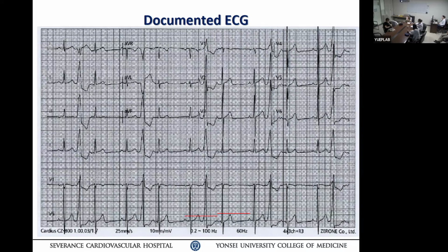But the biggest mistake is that they try to rotate a catheter without a guide wire. This is a problem, because these veins are more fragile than you think, much more fragile. So be careful with this stuff. Now, if you dissect, is there tamponade? No, unless you perforate with an ablation catheter. We never had dissection with tamponade. Like your LV lead replacement, same thing. Sometimes we put a guide wire out of the cardiac vein, pull it back, nothing happens because it's a low blood flow vessel, and then they clog up right away.